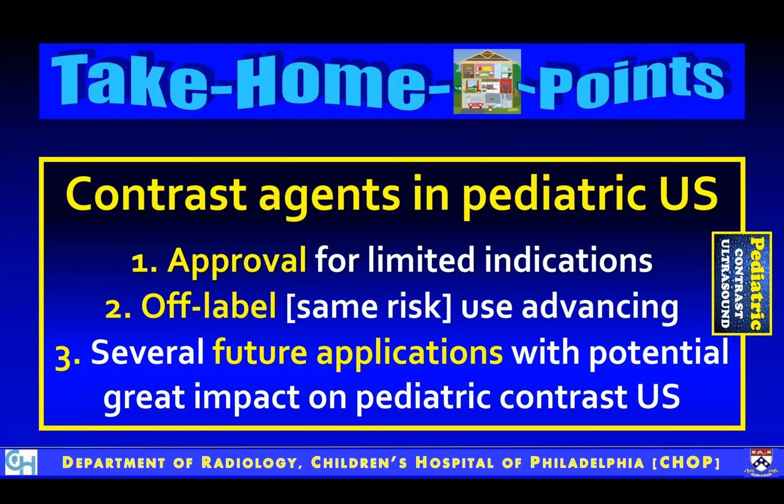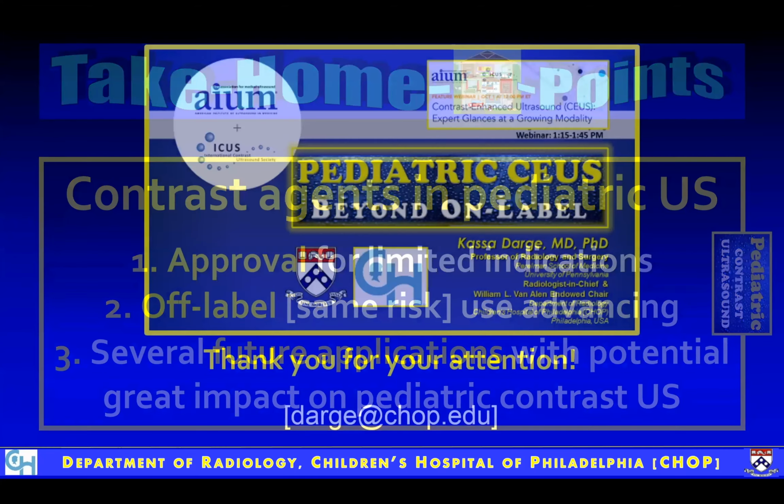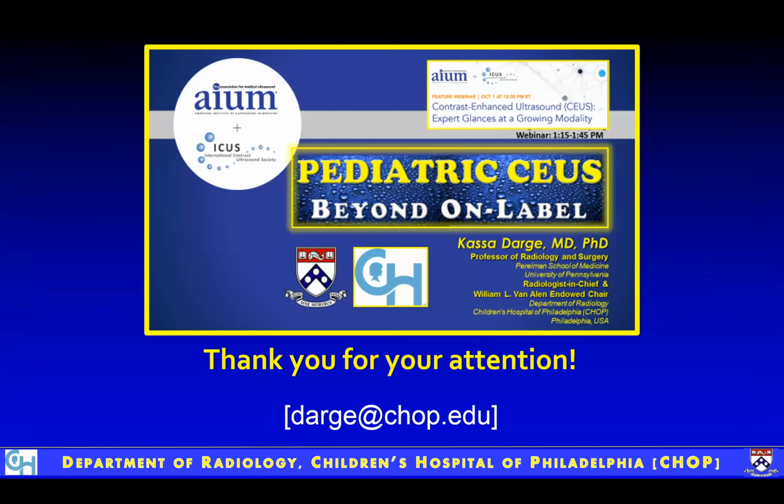Please do note that the route of administration may be the same, and the risk is based on the route and the contrast agents, and not where you place the transducer to scan. There are several future applications I hope I showed you with potential great impact on pediatric contrast ultrasound, beginning from the fetus. Thank you very much for your attention.